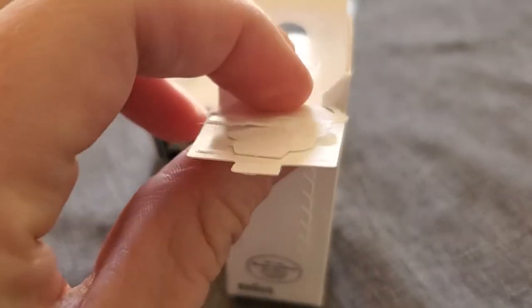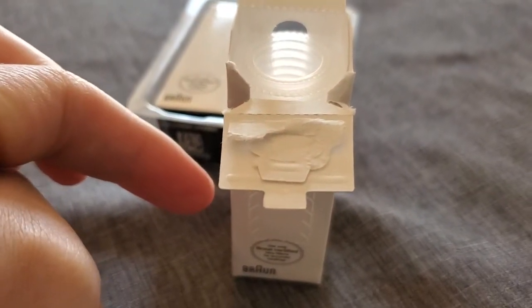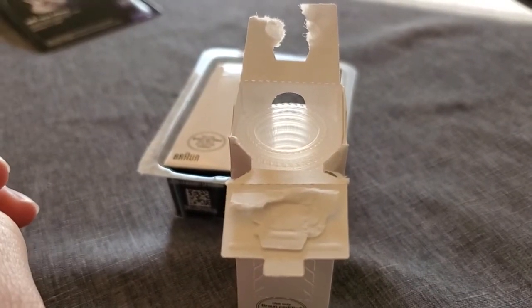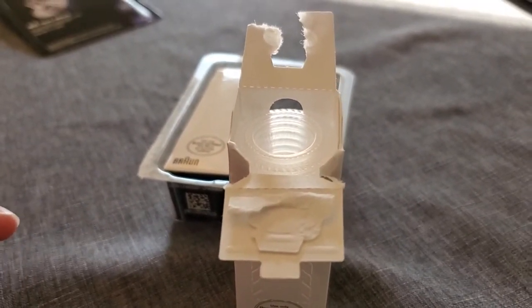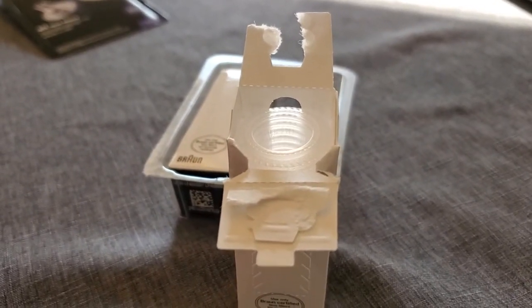You can see on these, as we're using them, we can just tear this little piece of the box down, and it lowers the level as we use up the covers, so you can still easily put that thermometer in and get your new probe cover — lens filter — off the top. So that's the Braun lens filters or probe covers for the thermometer.